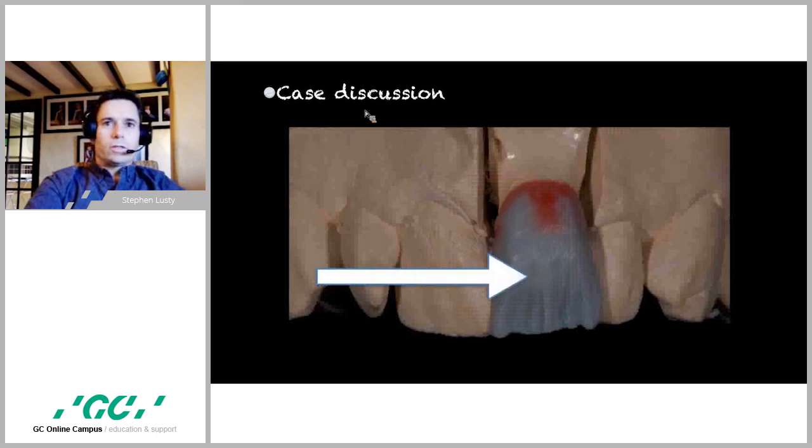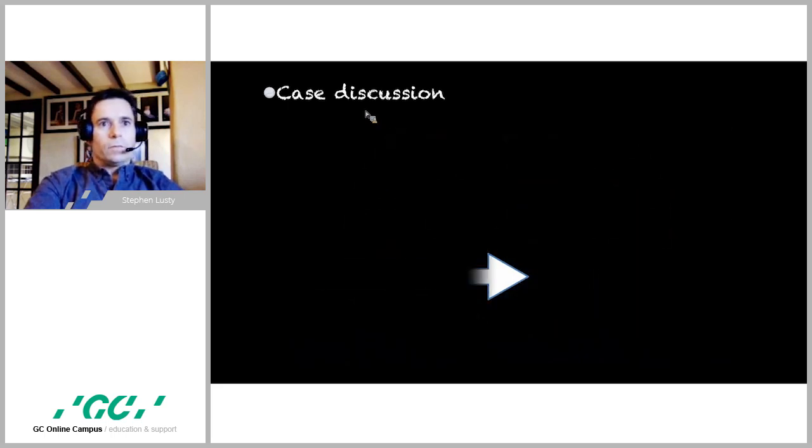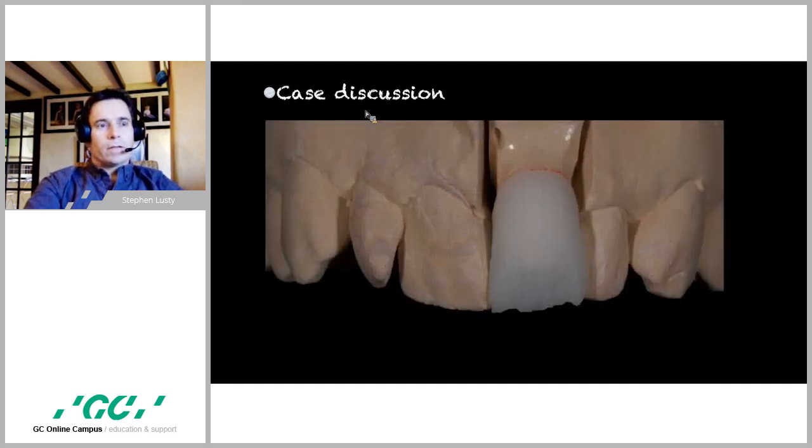But she wanted us to bring it into alignment as much as possible. So what are we going to do here? As I said, I'm not in the business of destroying teeth. So instead, we prefer to push the limits of the material. And with Lissy, I have every confidence that I will get a complete pressing with no tension in it and therefore no long-term cracking. We will come back to this case later on, but at this point, I think it's appropriate to discuss ingot selection and why and how I ended up choosing this ingot.